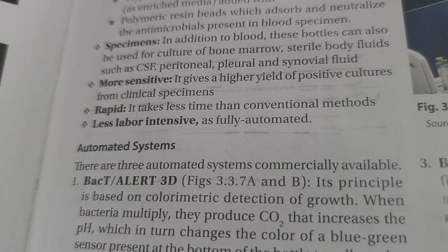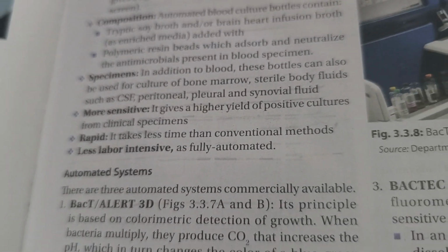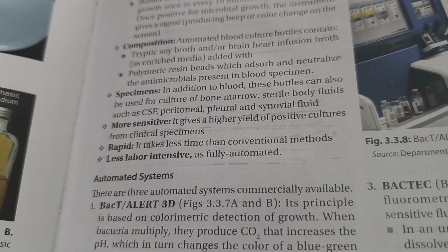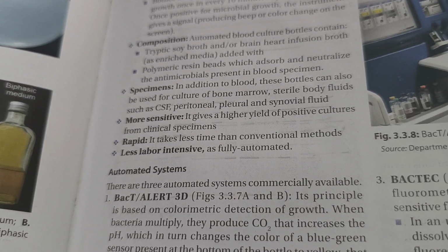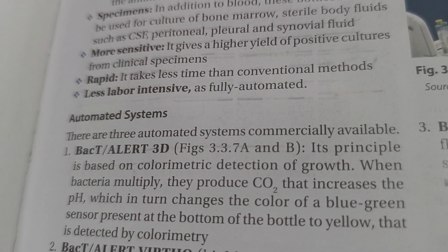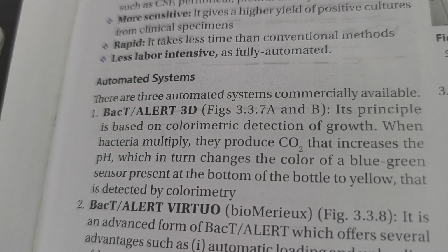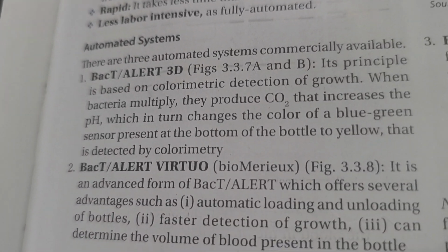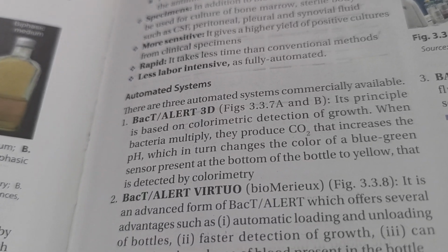In addition to blood, the bottle can also be used for culture of bone marrow, sterile body fluids such as CSF, peritoneal, pleural, and synovial fluid. More sensitive, it gives higher yield for positive culture from clinical specimen. Rapid. It takes less time than conventional method, less labor intensive as fully automated.